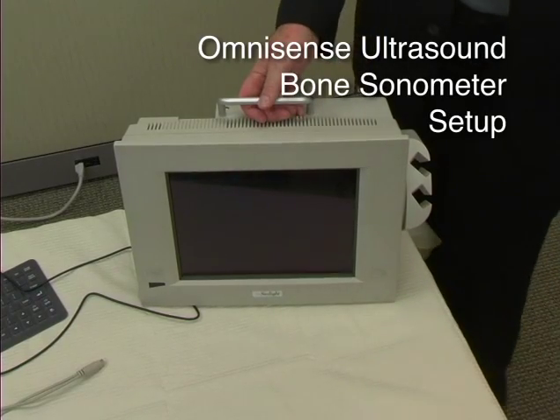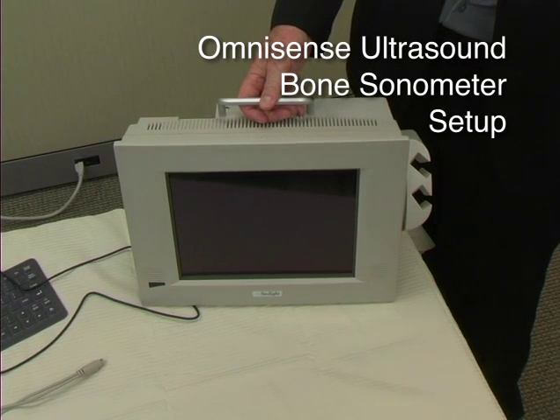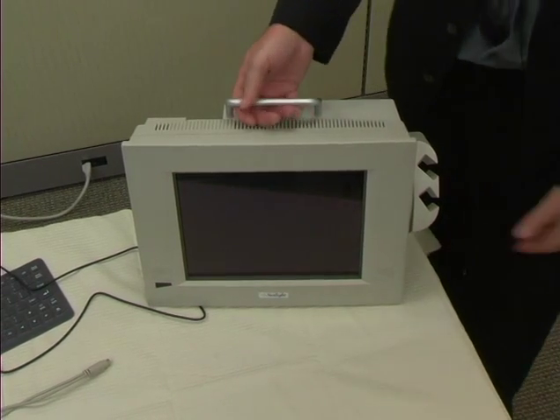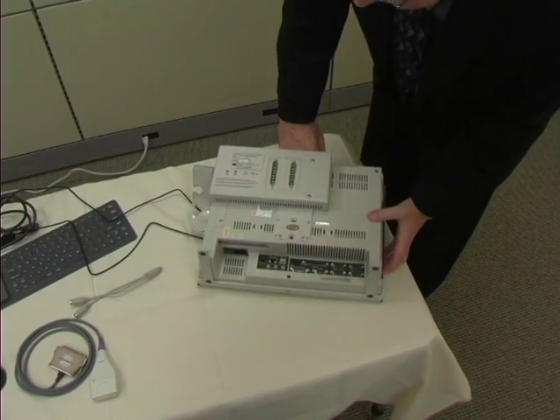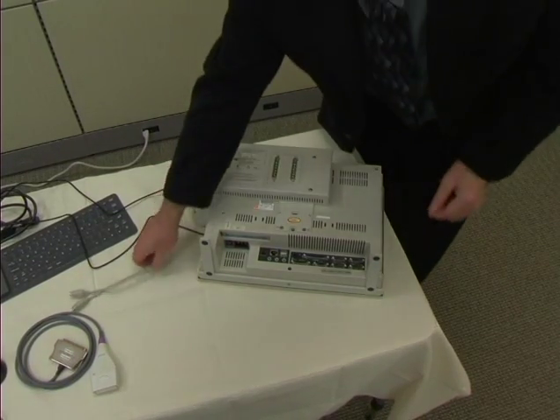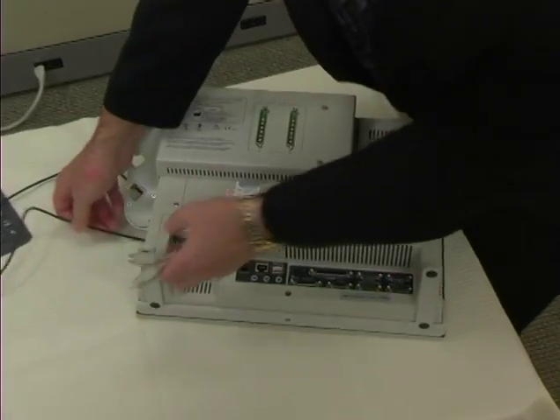Now we're ready to set up the unit. We want to position the unit in an ideal area where the space is away from heating and air conditioning, because it can affect the results. Then we attach the keyboard and mouse to the unit. The attachment areas are all either at the bottom or in the back of the unit itself.